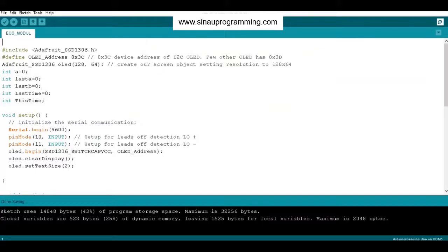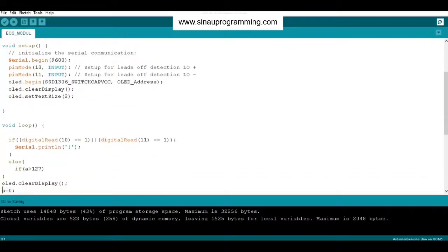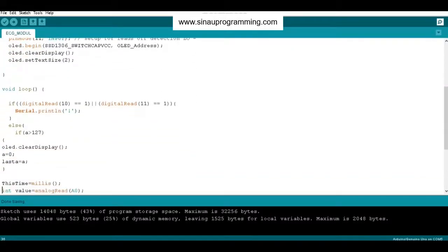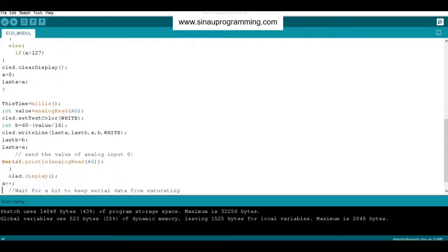When you want to start programming, don't forget to insert the libraries. This time we are using the library for the display. First, add the Adafruit SSD1306 for the OLED display. You have to make sure of the I2C address on your device. In this case, we use 0x3C as the address.